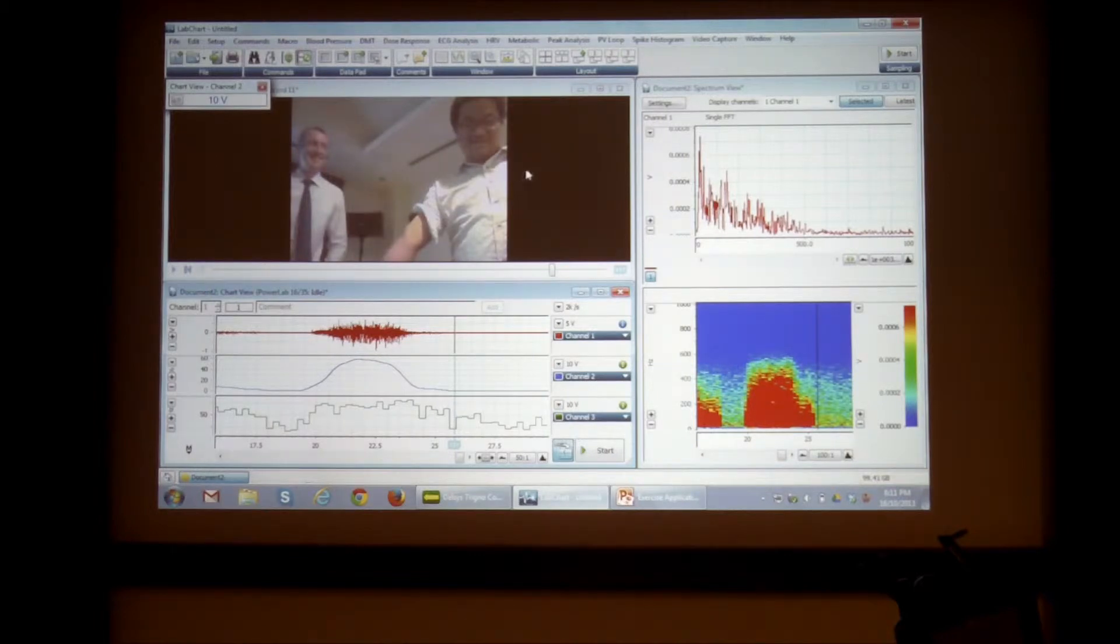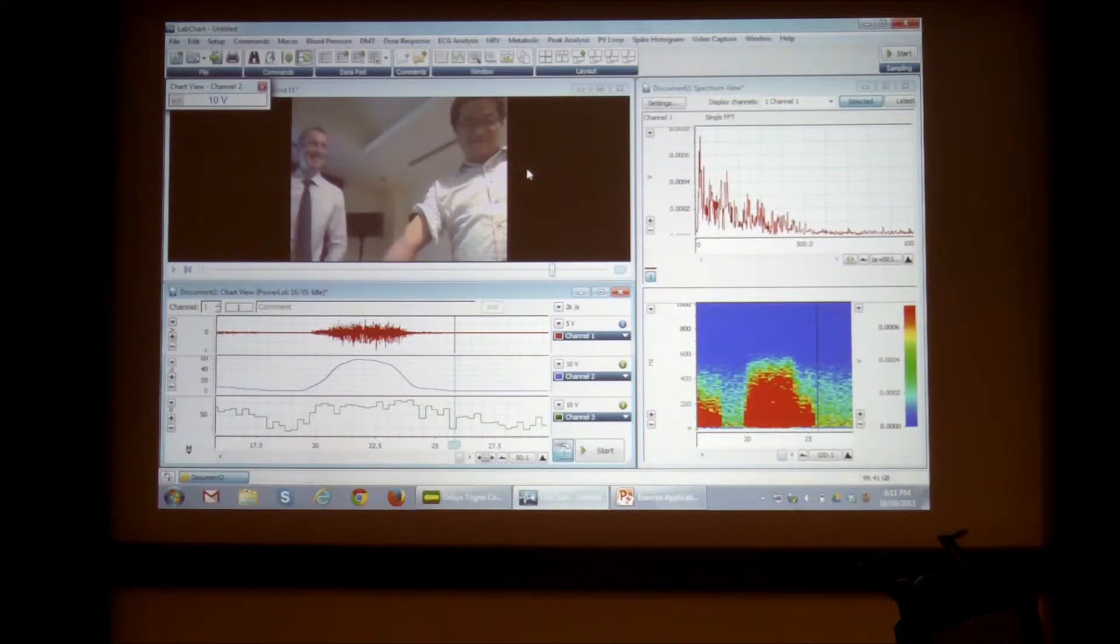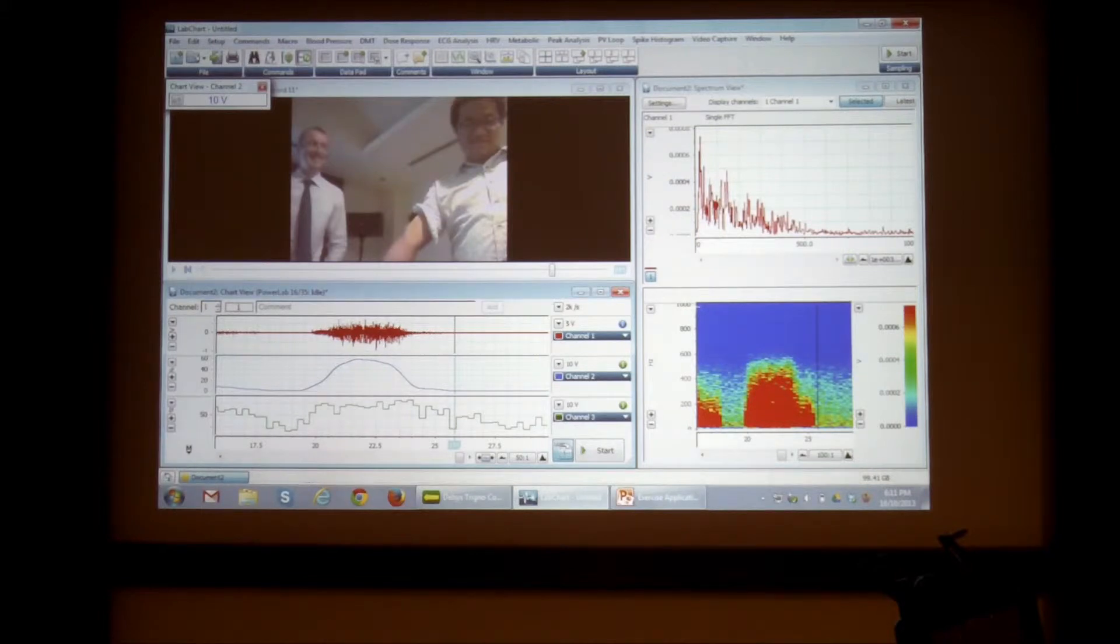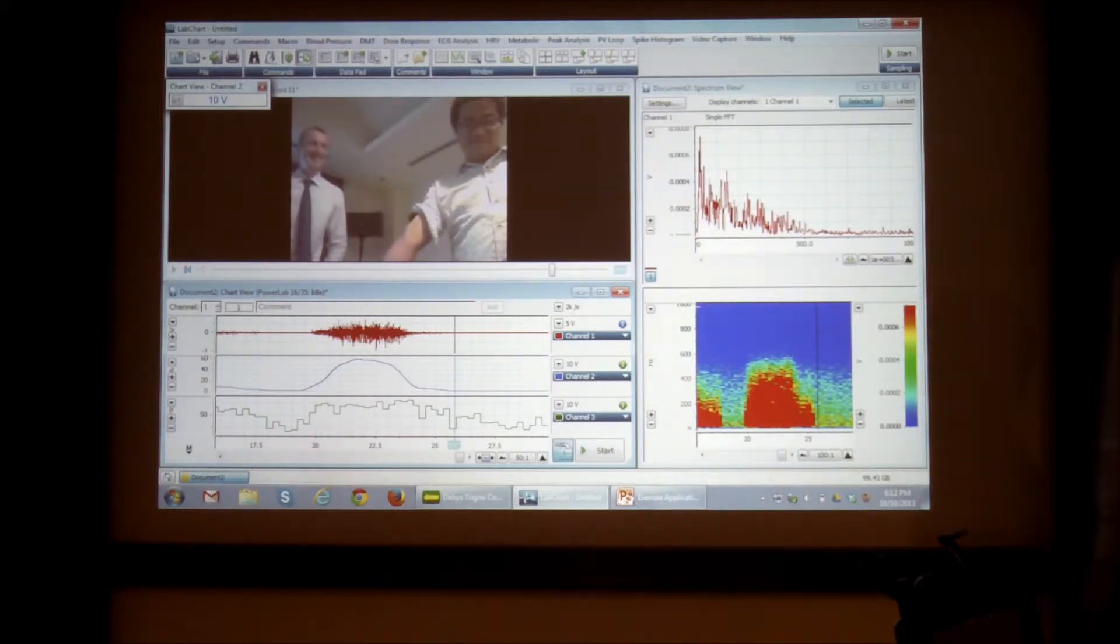So this movie is actually also stored in a separate file as well. Yeah, that's basically EMG recording and analysis in lab chart.